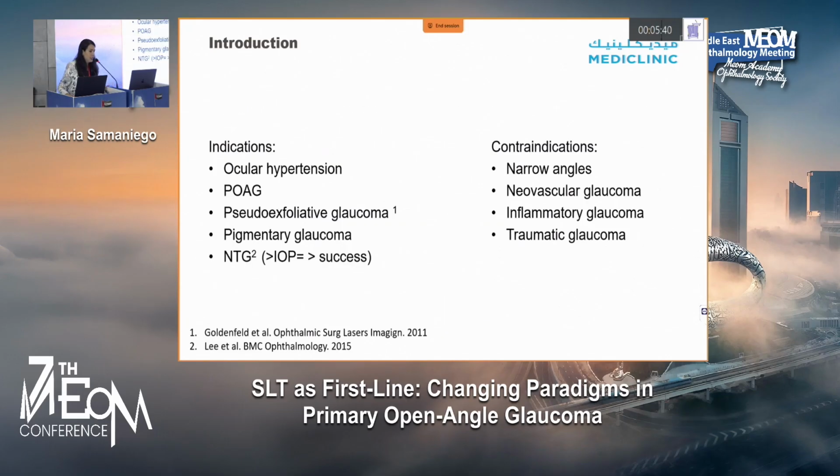What are the indications? Well, basically open-angle glaucoma. Also, we can use it in ocular hypertension, pseudoexfoliative glaucoma. However, the response is not as good as in primary open-angle glaucoma. We can use it also in pigmentary glaucoma.